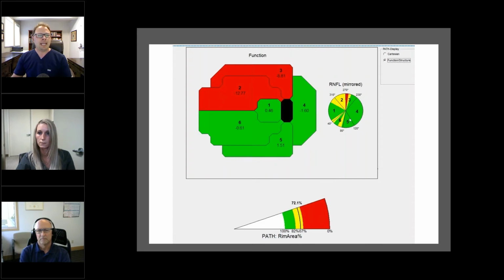And I kind of feel like I have an advanced view of what it's going to look like. The way that I use it usually, though, is I'm trying to confirm that the defect on the visual field matches the defect on the OCT. And that's confirmation that we've got a match. It helps confirm the diagnosis. And so it's useful in that category.